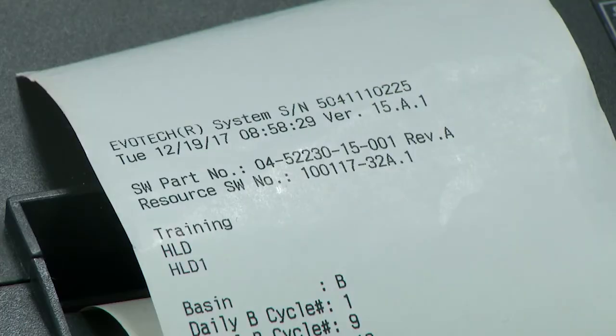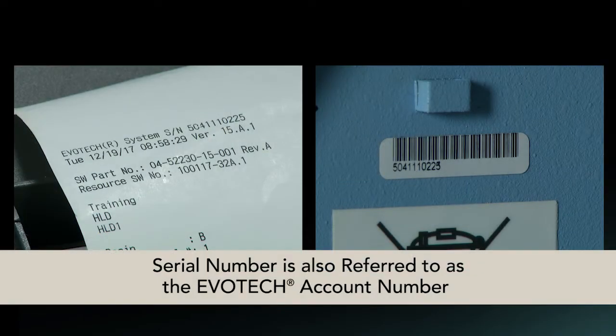The serial number is located on the top of each printout and on a small silver plate found internally on the left side of the device. When calling for service, this serial number is also referred to as your EVOTECH account number.